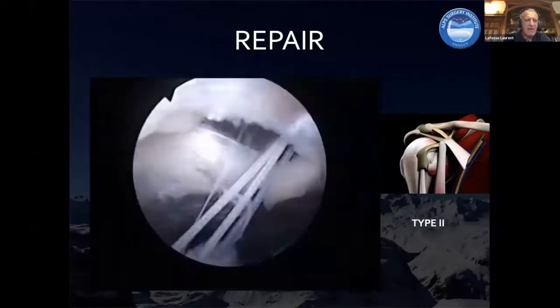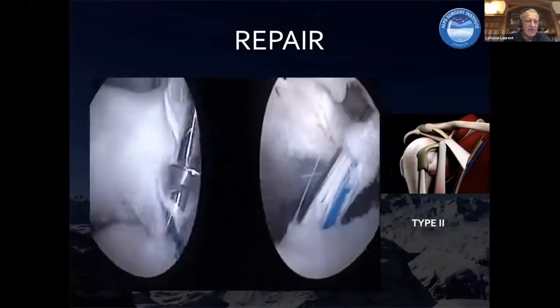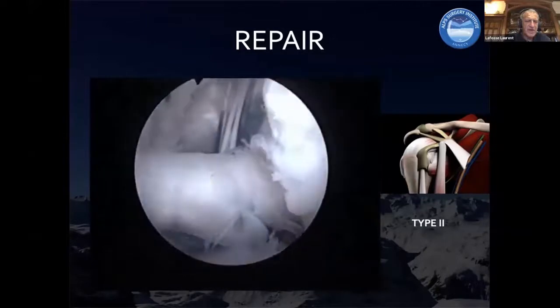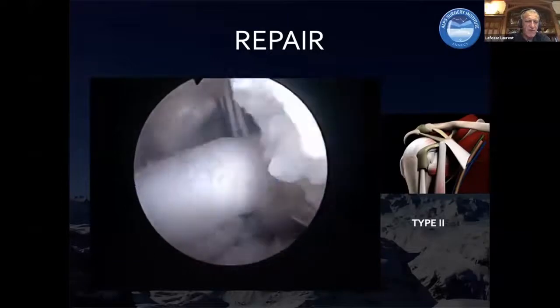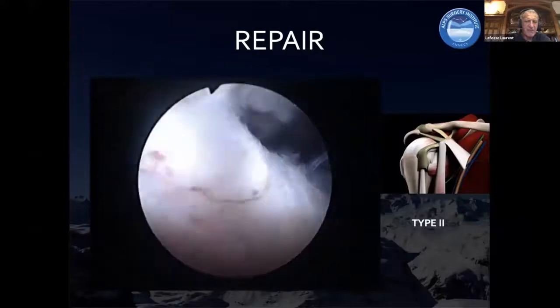It's very important not to over tighten this. Here you see that we just bring the tendon back to the lesser tuberosity with 2 anchors. This is an old video with 2 metallic anchors, and we bring the tendon back here. We should avoid over tightening this, because otherwise the patient will be very stiff and painful post-op.